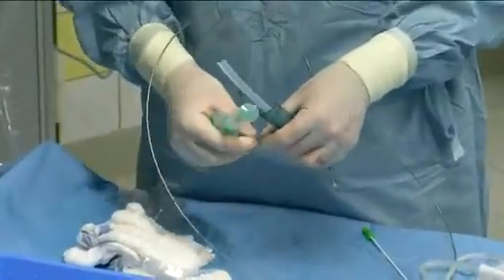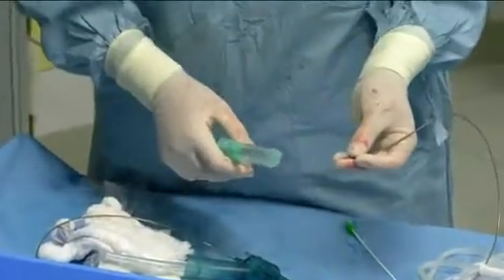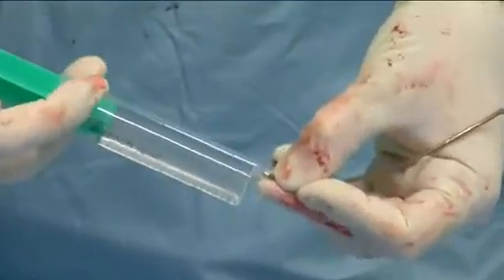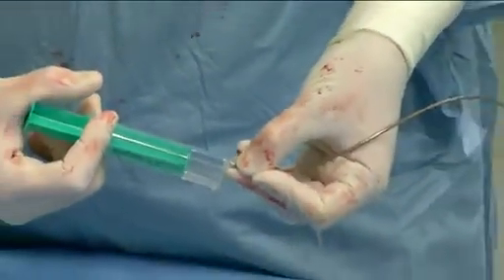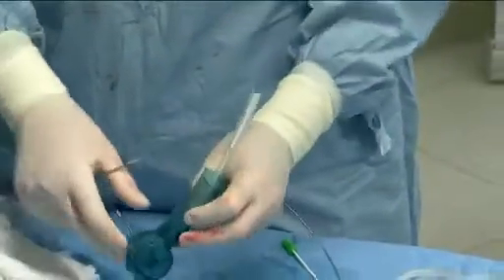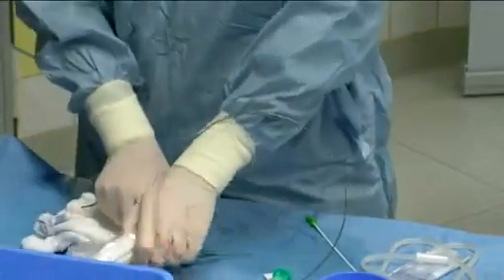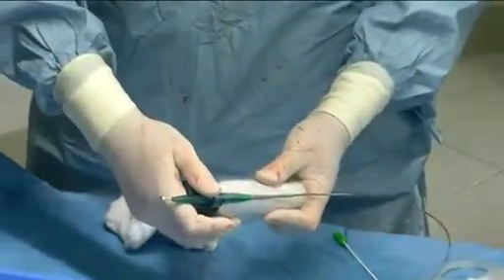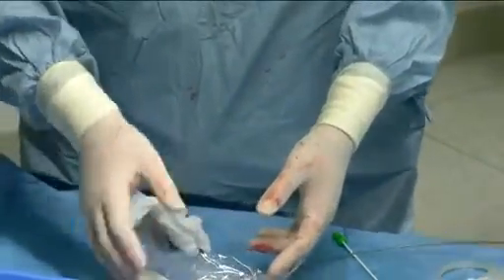Before usage of the catheter, you really have to flush the catheter. You can do it like this: hold it like this, put a syringe on the tip of the catheter and inject some saline, filling the whole catheter with saline, and then you're done. The next step would be to connect the catheter with the driving machine, as you can see here. Just put these both parts of the catheter together like this, and now the machine is ready for usage, and we now insert it into the bypass.